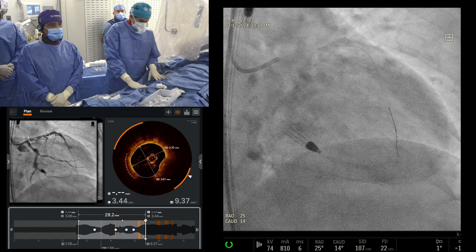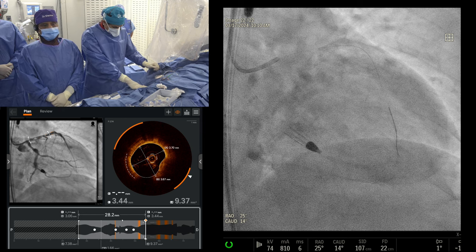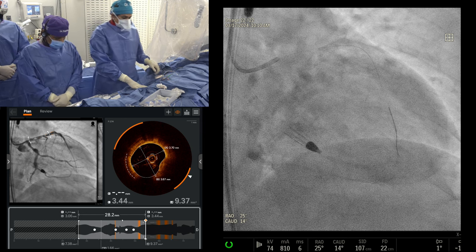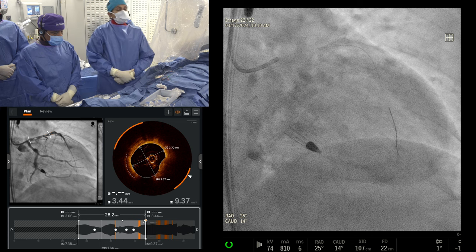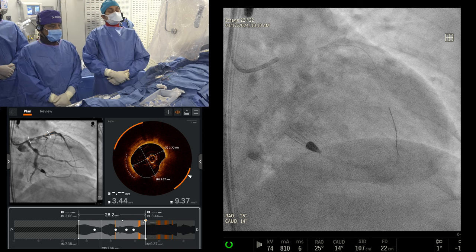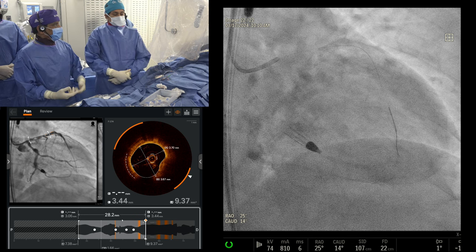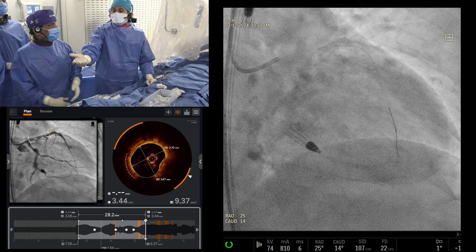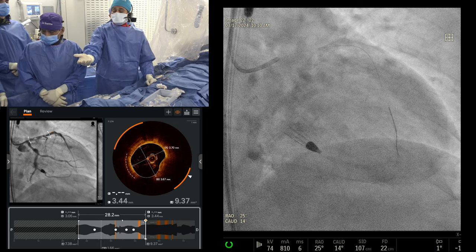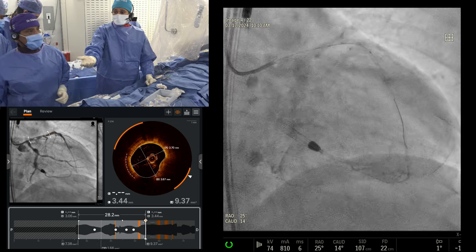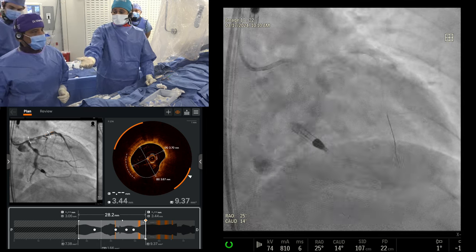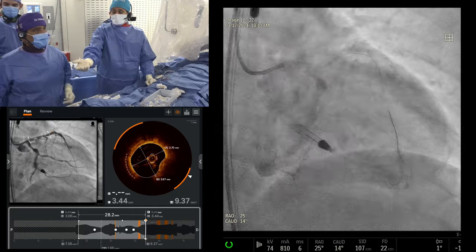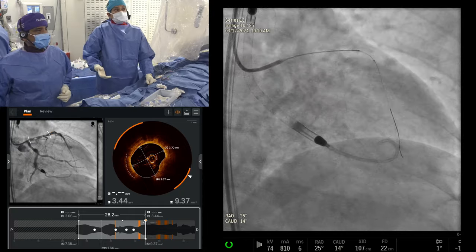The 5mg dose gives you pretty equipotent effects to clopidogrel, although more consistent without the variability in genetic response. The 10mg, of course, is much more potent. So: 3.5x20 balloon. Based on this OCT, no orbital atherectomy in this case — we're just going to go with the balloon and a 4.0x38 stent.